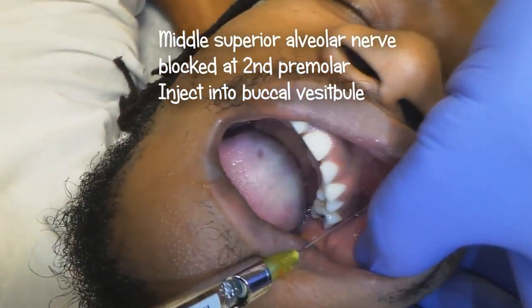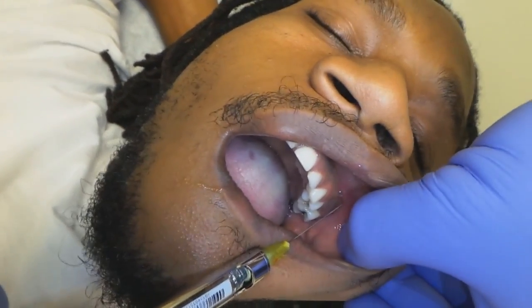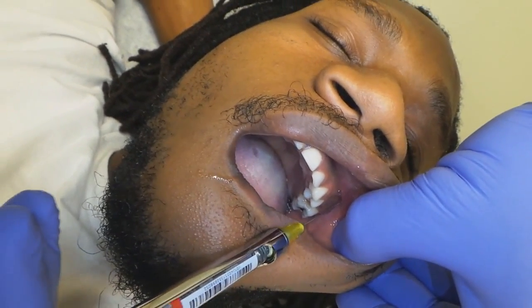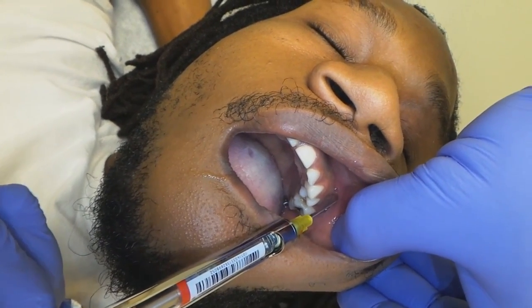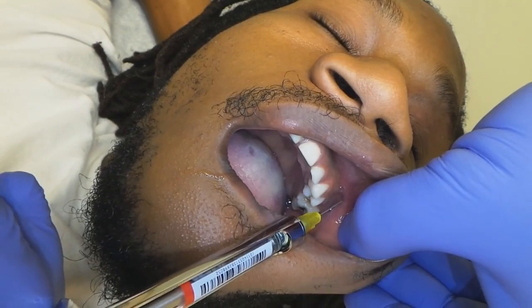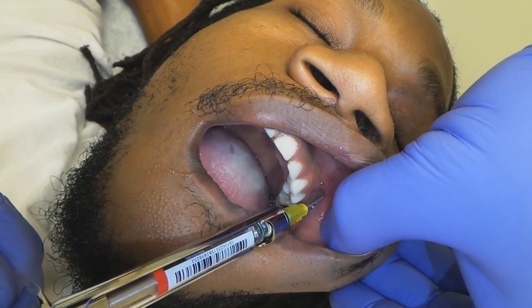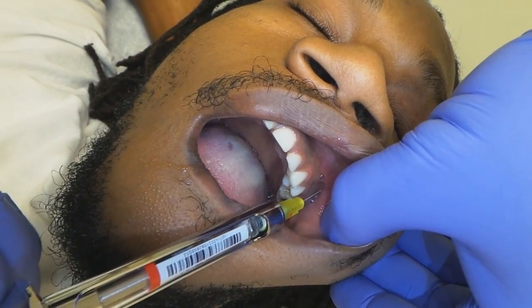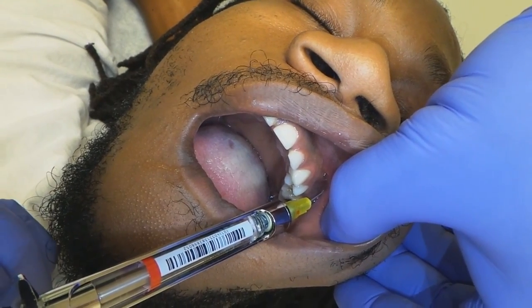The buccal vestibule is right there. I'm going to advance a little bit and give a little bit as I go. There are no major arteries right here. When you do the PSA, there are a lot of major arteries that run through there, so you do need to aspirate. Once I got it in about this far, no positive aspiration — deposit the anesthetic.